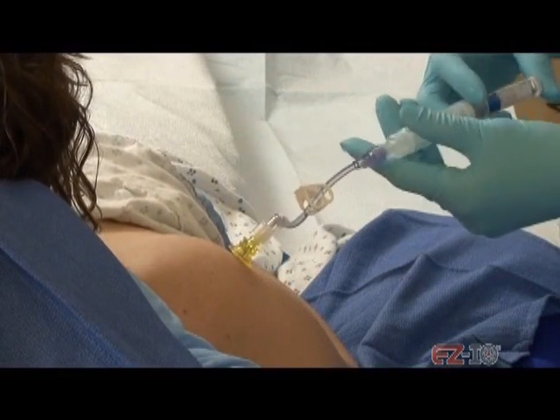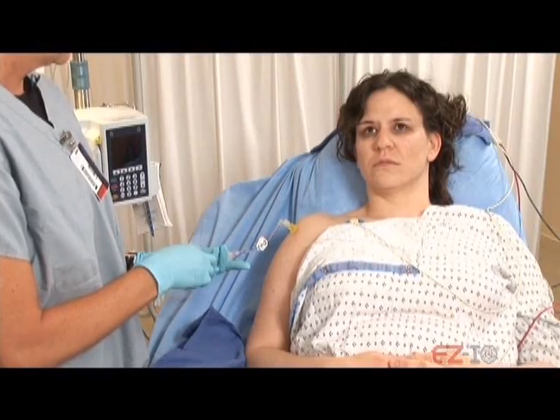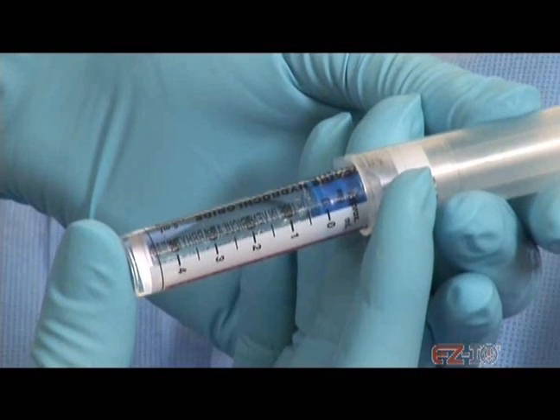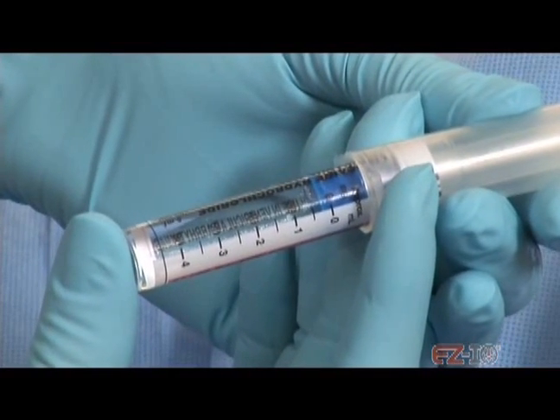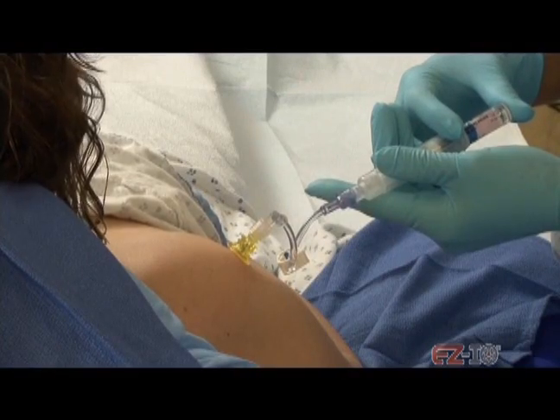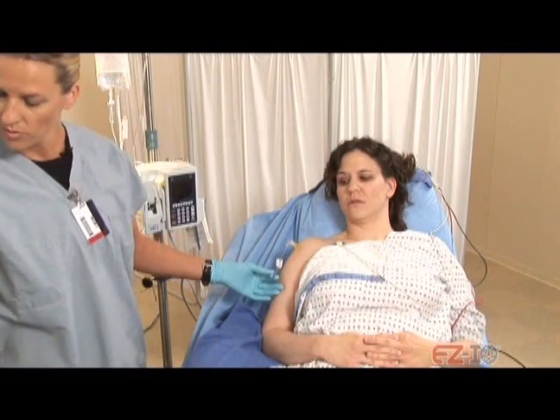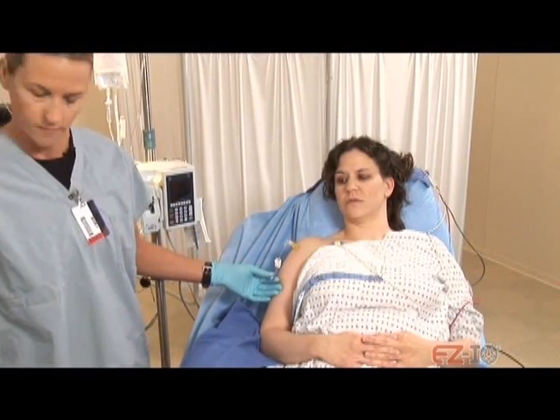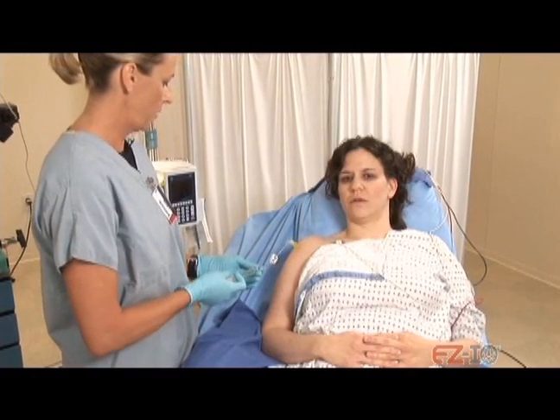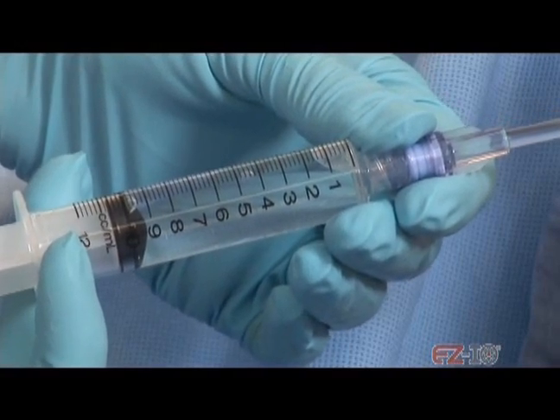If the patient is alert or responsive to pain, begin administering 2% lidocaine very slowly in approximately 0.2 milliliter increments. Titrate lidocaine administration to patient response. Still doing all right? Following administration of the prescribed dosage of lidocaine, administer 1 milliliter of saline very slowly to ensure the patient receives the lidocaine remaining in the Easy Connect. Go a little slow again. And I want you to tell me when we're to the point where you're not feeling pain.